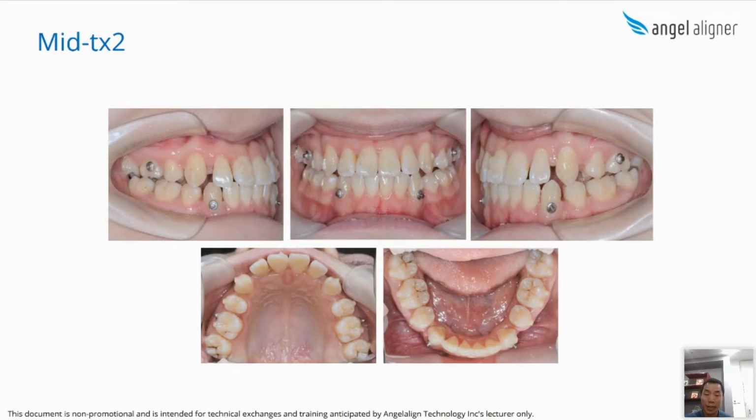What did I do in this case? I encouraged the patient to wear aligners all day long, except for brushing. It must be emphasized here that oral and aligner hygiene maintenance are particularly important in this way. And I stopped changing the upper aligner, waiting and retaining with the current aligner, and the lower aligner proceeded as usual until the occlusal interference was relieved in natural occlusion.